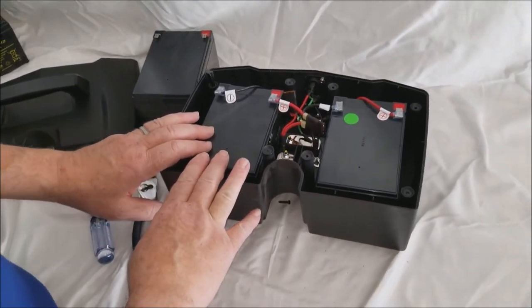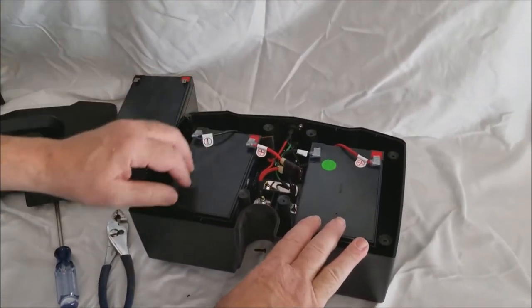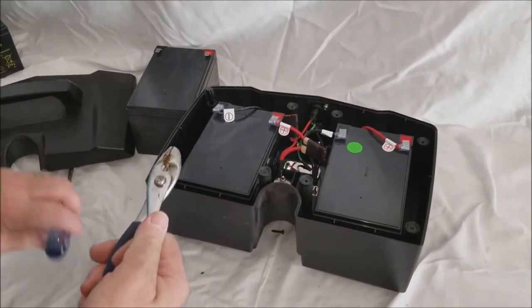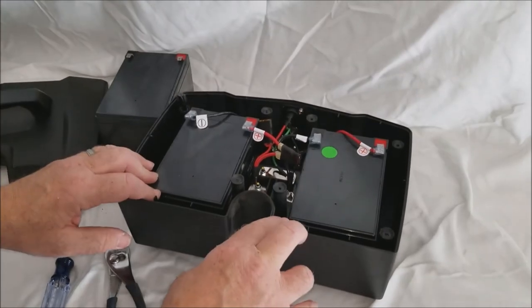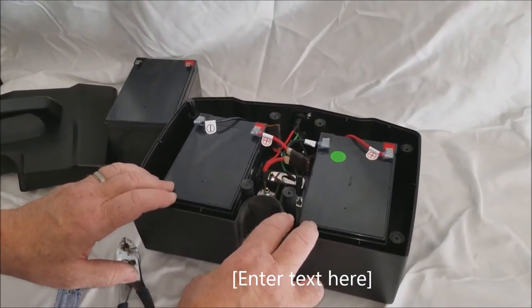Now, you may have a battery pack that uses taller batteries that have nuts and bolts that connect the wires, but the connection process is the same. You would use your pliers and your screwdriver to take the connectors off. Again, lift the batteries out, put the new ones in place. You just want to make sure that you don't mix up the wires. So again, a sketch might be handy.